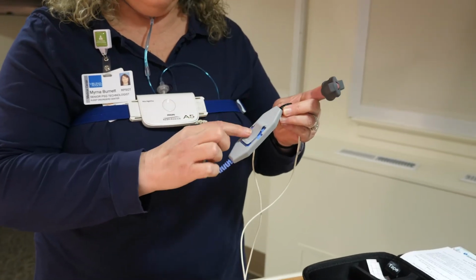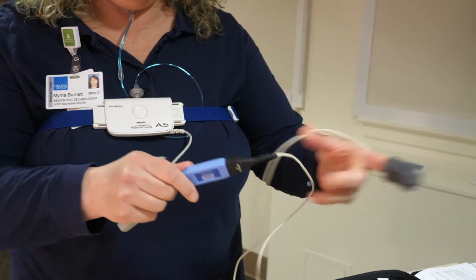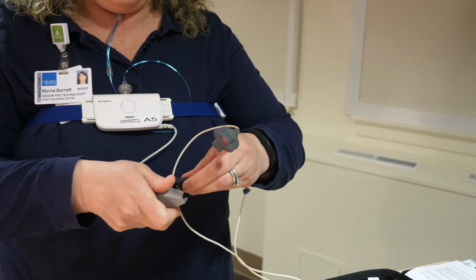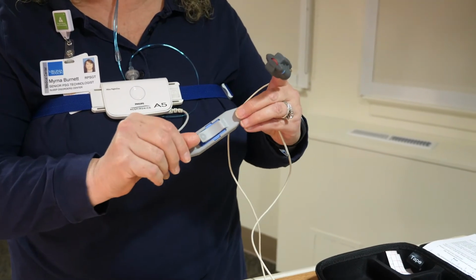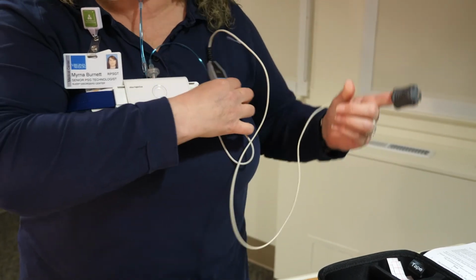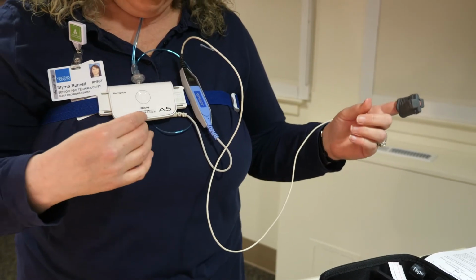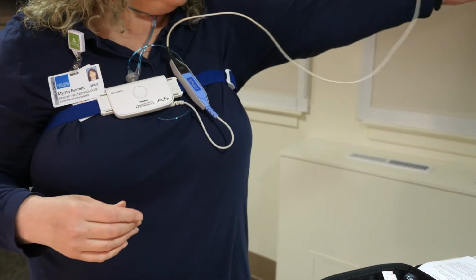So this here is a clip that just holds the oximeter to the device connector. It keeps it from falling off. Because this is so bulky, they made a little clip in this. So what you can do is we'll often just slide them over the belt to kind of keep it out of your way. You can slide it closer to the unit to keep it away or closer. You still should have plenty of room to stretch out your arm as far as the cable goes.